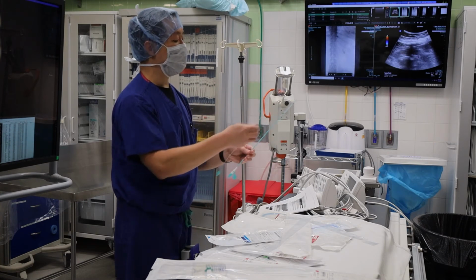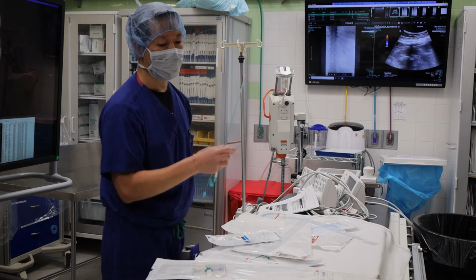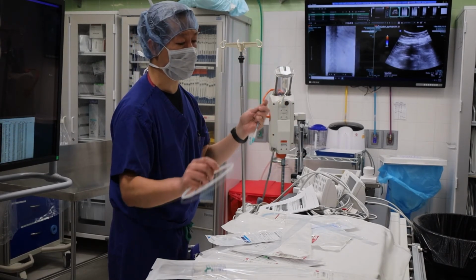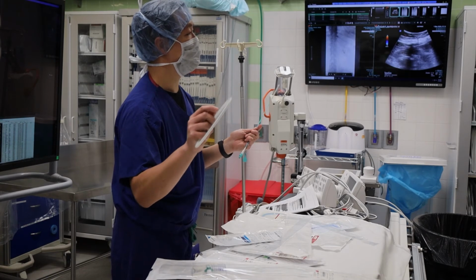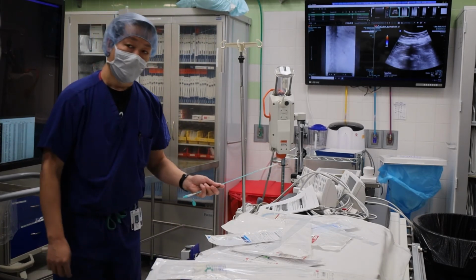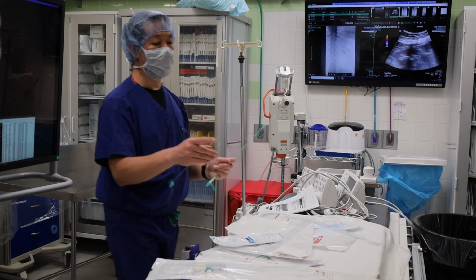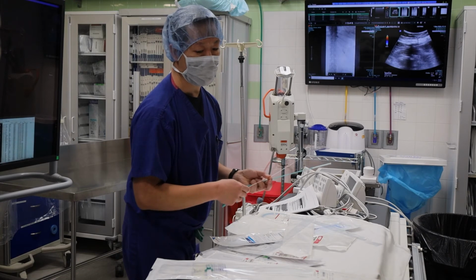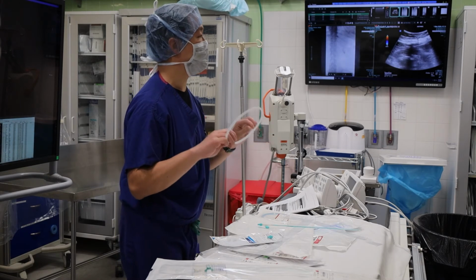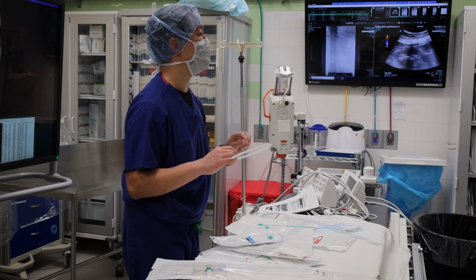If we switched it around so that we place it with the plastic, if you're lucky you can get it in, but what you don't want is to kink this wire, because this is way stronger than this, and if you're in the wrong trajectory, you will kink this. And then now nothing goes over it, and now you have to somehow exchange and you've kinked the wire. If you're trying to push it in on this, that's when things might not follow. In terms of wires, the stiffer your wire is to give you better support, the easier it is to kink. Right? It's more rigid. That's right.